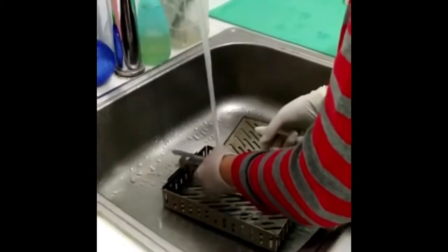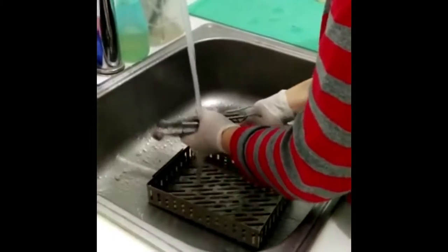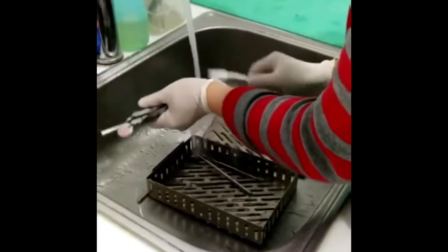For this first step, all dental materials should be cleaned thoroughly. With a brush, it can help you clean easier and faster.